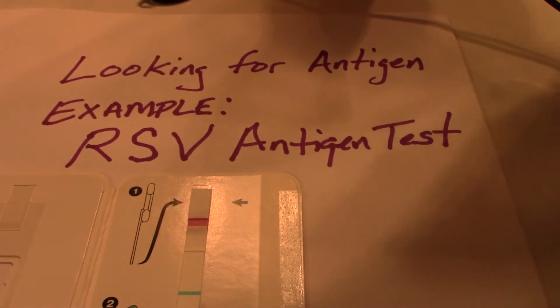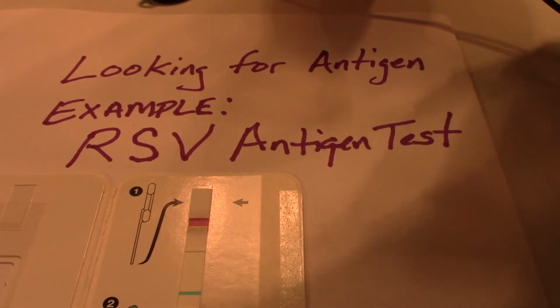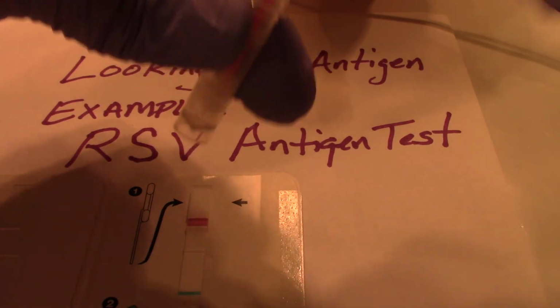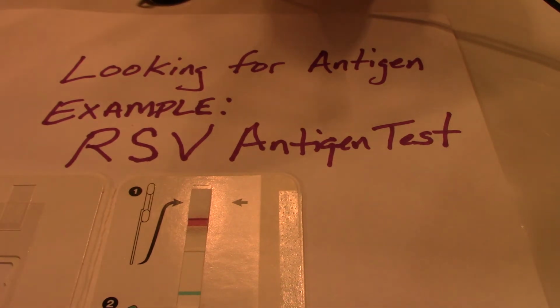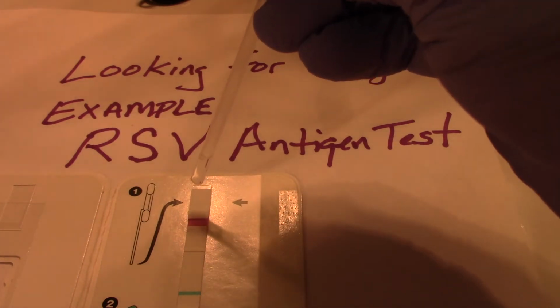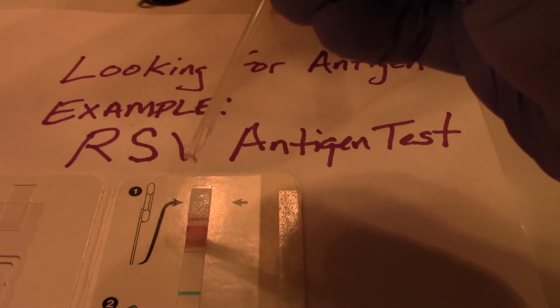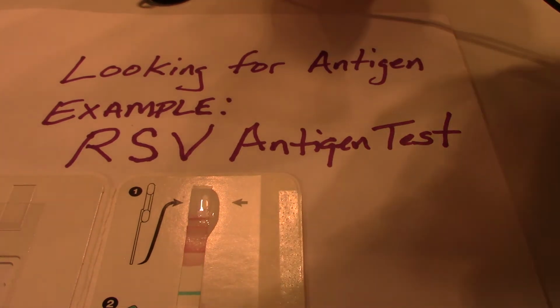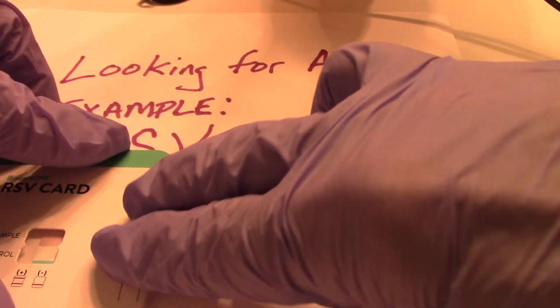We're going to take our first sample, where the swab has been mixed, and add it to our pad. I'm going to close our pad while the reaction by capillary action occurs.